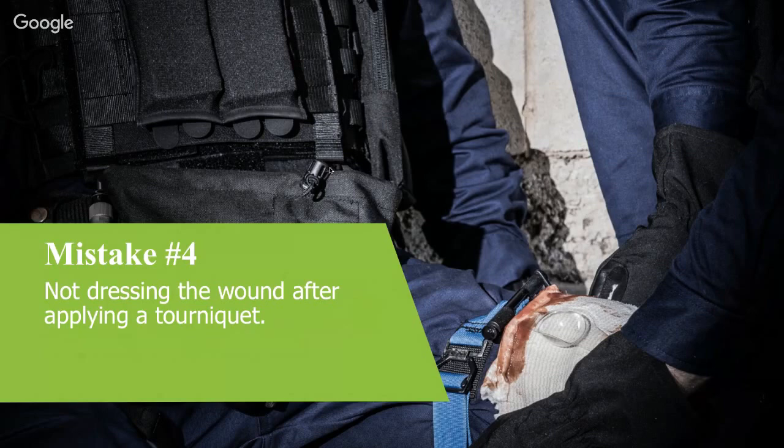Now, certainly you do want to come back and dress that wound after you've applied a tourniquet. There's a couple of reasons for that. The first priority is to cut off that blood supply. That's what your tourniquet does. So when you look at, say, your primary response acronym, and Stuart's just mentioned it there, the dressing is in C of MARCH. Spot on, mate. Thanks, you've done my job for me there. So the M is your massive hemorrhage, and that's where you put your tourniquet on. Once you start talking about dressing the wounds, that's when you're coming back to the C.